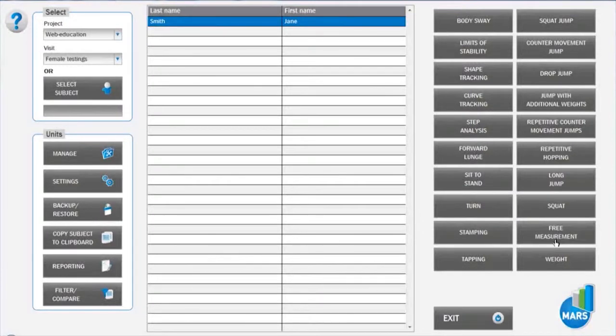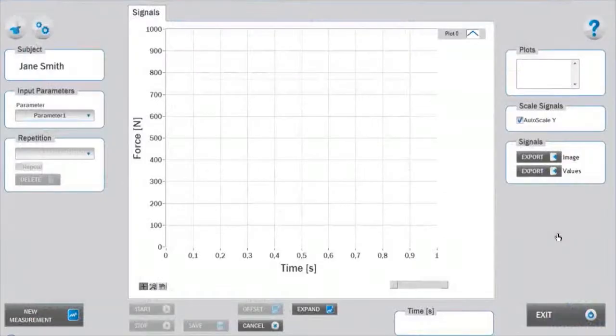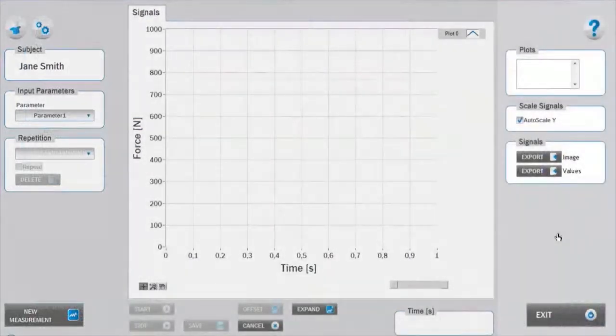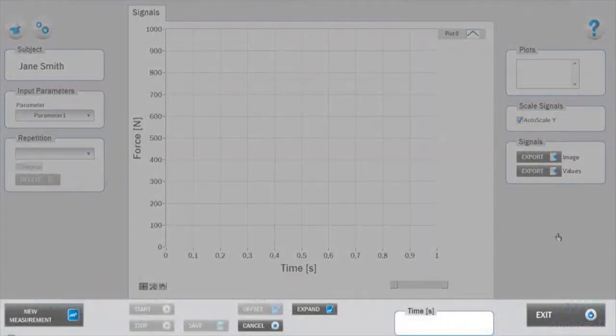The free measurement test module can be entered by clicking on the free measurement button in the main window. As with the organization of all MARS test modules, the interface is divided into a left setup panel, right analysis panel, bottom measurement panel, and central signals area.